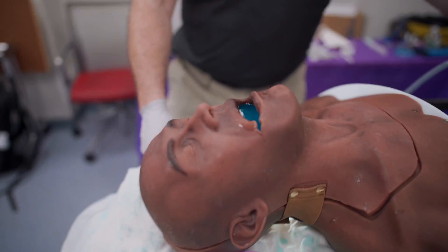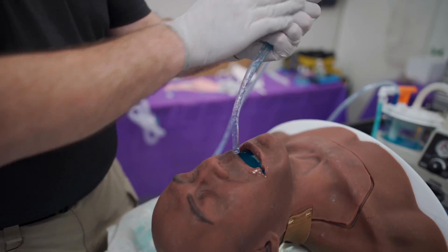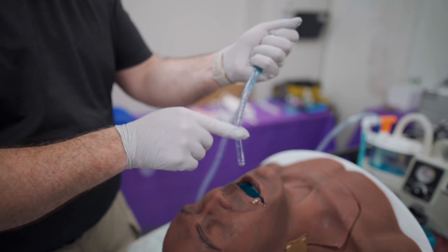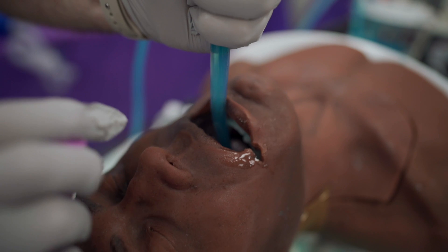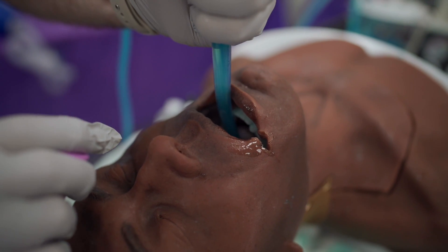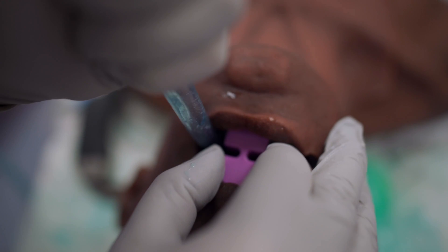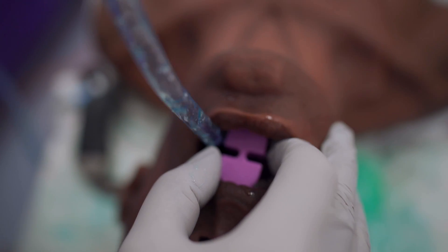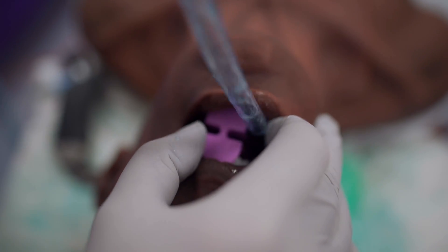I'm activating a portable electric suction unit and I'll begin by holding the suction catheter in a reverse angle with the anatomic curve facing anteriorly. I'll begin to decontaminate the oropharynx of the mannequin, and as I reach the hypopharynx I'm going to push the tongue into the floor of the mouth and place the airway in anatomically proper orientation into the patient's pharynx. I'll also suction to the other side of the oral airway and then remove the suction catheter.